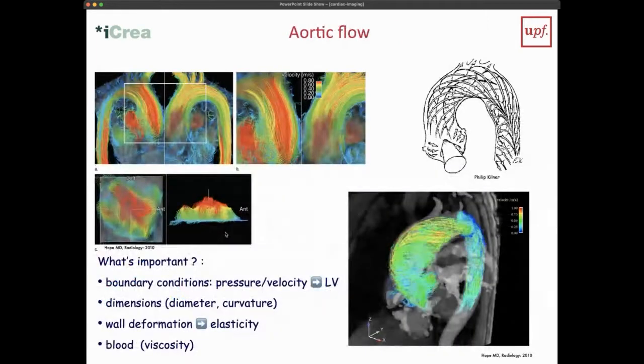But what we actually can do is we can really measure the 4D vector of the flow. With Doppler, you can only measure the flow in the direction of the probe. We cannot, with Doppler, directly measure the other components. And of course, velocity vectors have 3D, so they have 3 components.